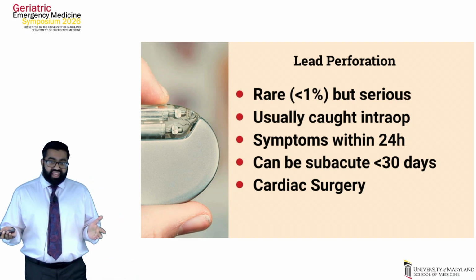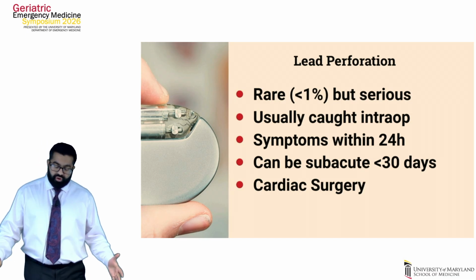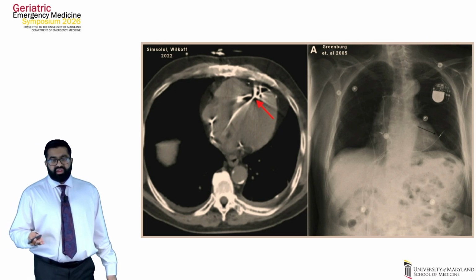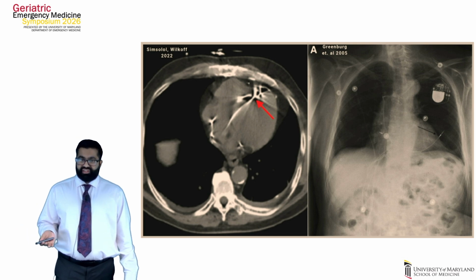But there are actually case reports where there are subacute presentations of these. And of course, these need cardiac surgery. This is something that you might see. So there's RV perforations, but there's also septal perforations of the lead.